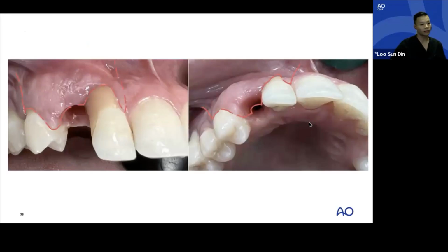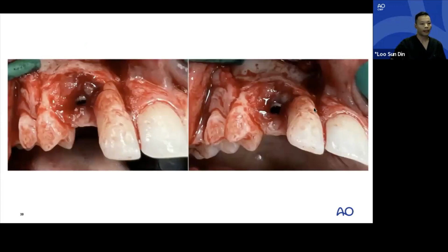Wide incision again, avoiding the papilla. This time around, two vertical incisions because of the massive loss of mucosa and soft tissue; I anticipate a lot of extension and rolling in palatally. And this is the horror that we see after you raise the flap. Extensive granular tissue around the 1-3 implant. The 1-2 is shaky with almost no bony root coverage and some form of tooth color filling on the root just to mask and increase aesthetics.